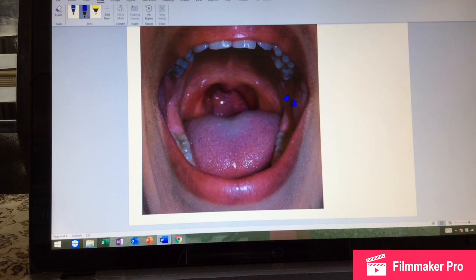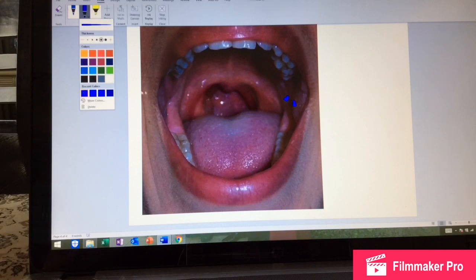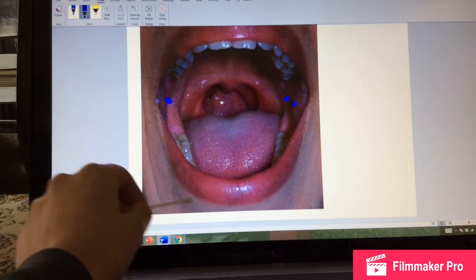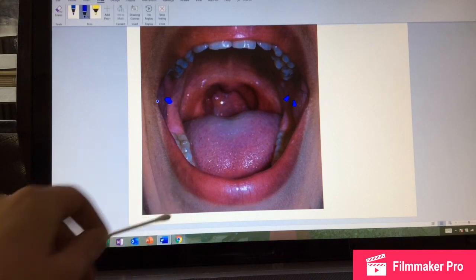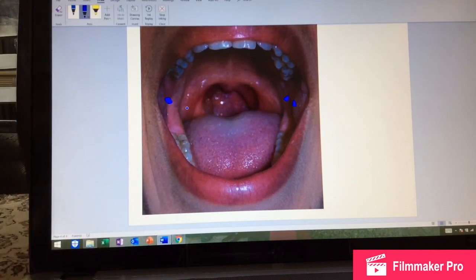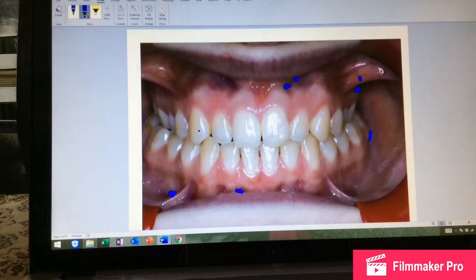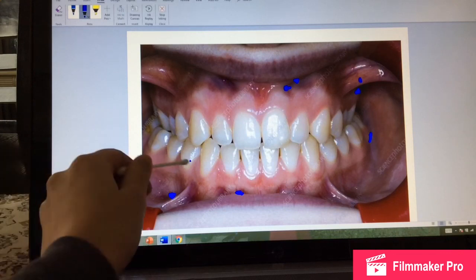So now we're going to be doing tooth number 28, and we're going to do a mandibular block, another IA block for this tooth, because this block is going to be placed right here. This one numbs this area and half of the tongue and the tissues facial to the premolars as well. Okay, so that's the IA, and then the other one we need to do is also infiltration for this tooth, which is this one, number 28.